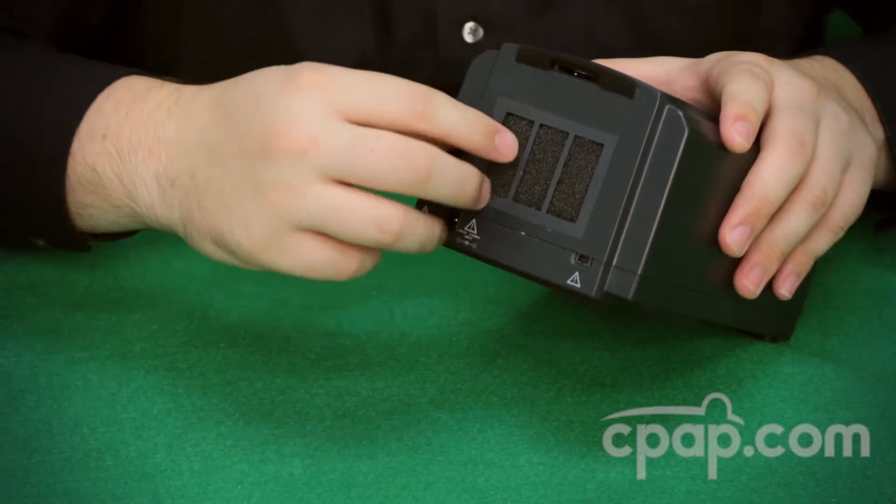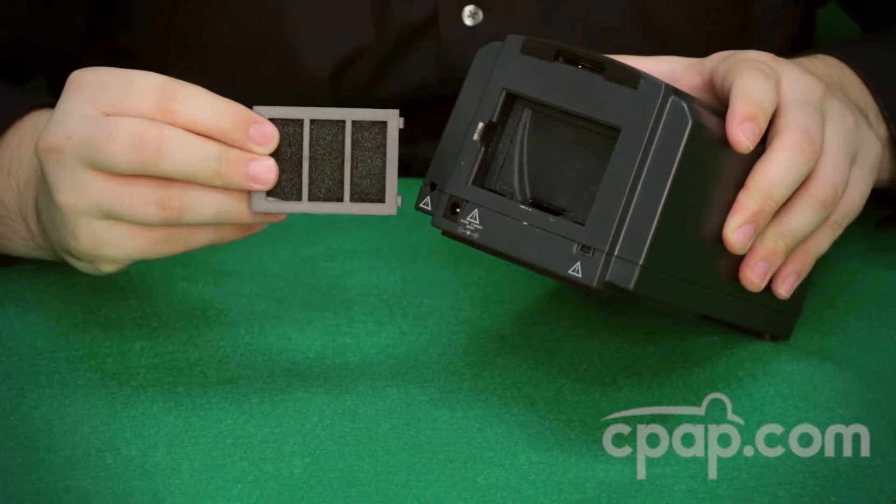With the filter end of the machine facing you, remove the cassette from the machine by lifting the tab on the left side of the cassette.